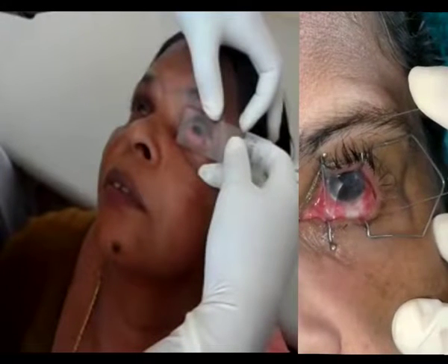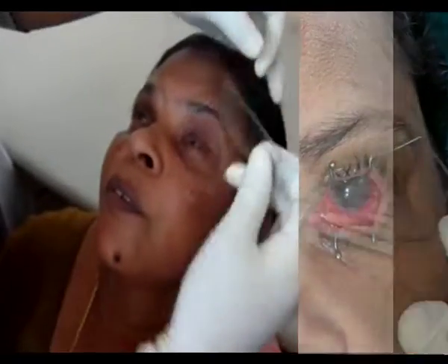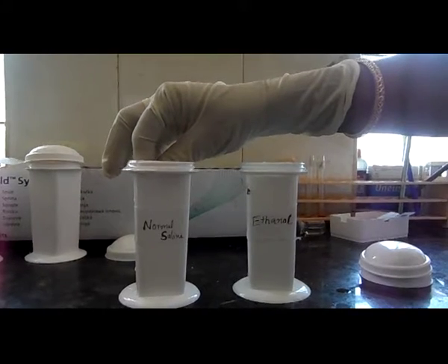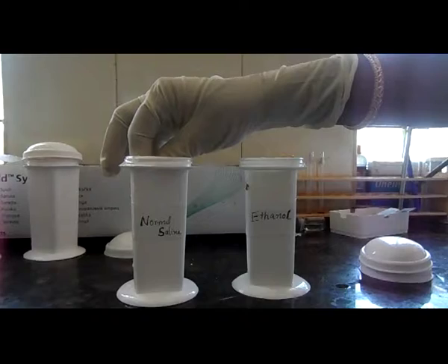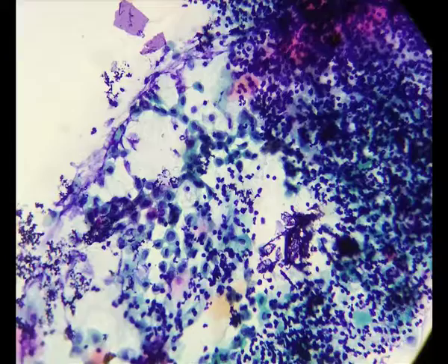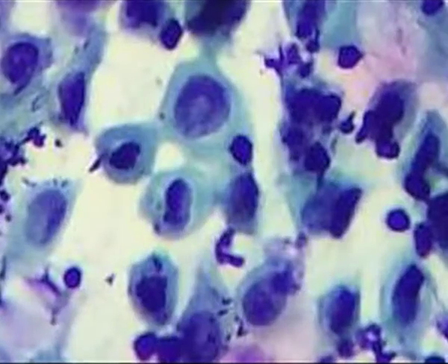The slides are allowed to air dry for better retention of all collected cells. Then the pathologist rehydrates the cells in normal saline for 30 seconds to reverse the effects of drying. Wet cells are then fixated with 95% ethanol and stained with Papanicolaou stain.